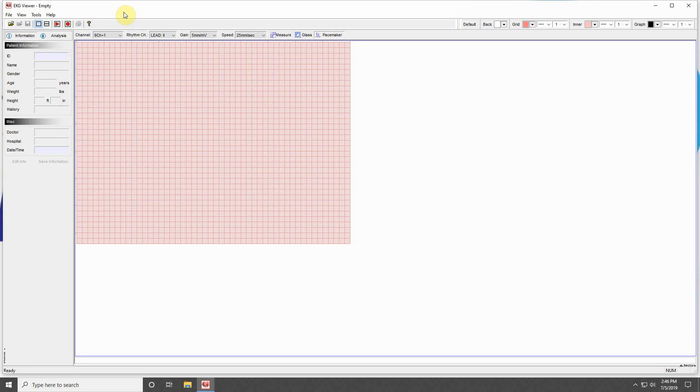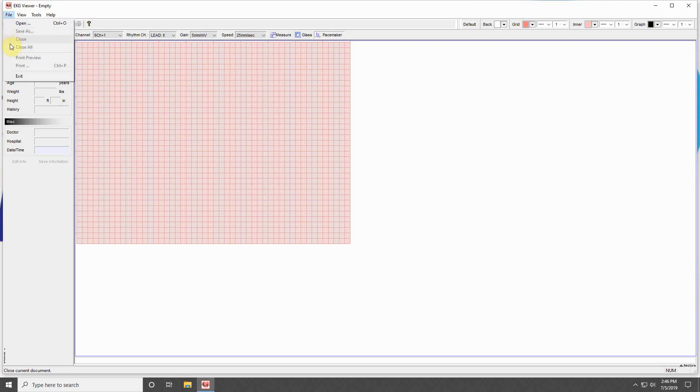Starting from the top left, you will find the File menu, which will allow you to save, open, close, or print any selected ECG study. You can also exit the program from this menu.